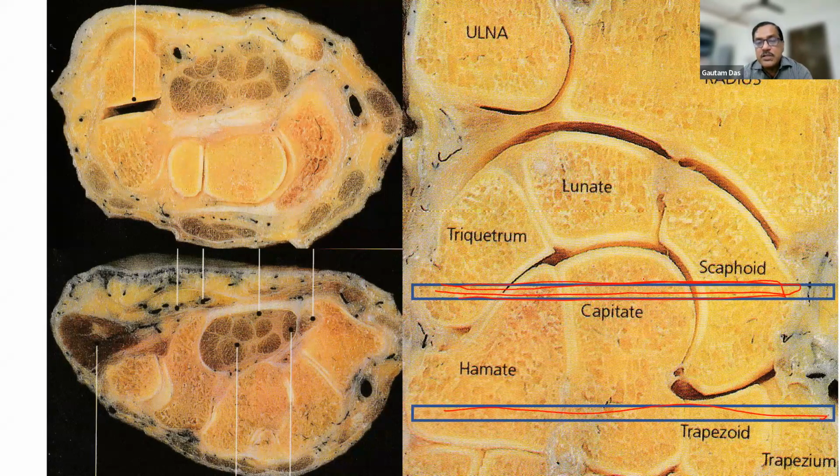So in the base, the lunate is not there. This is one of the very common mistakes I have seen done by many of the fellows. As I told you, lunate is a very superficial, prominent bone. So what we have to do is slide the probe to this side. As soon as the lunate disappears, then only will the proximal carpal tunnel be reached.